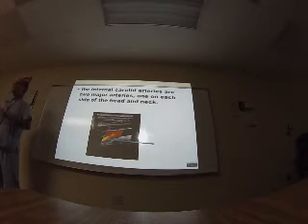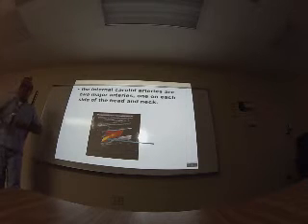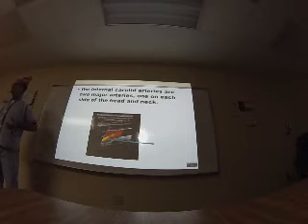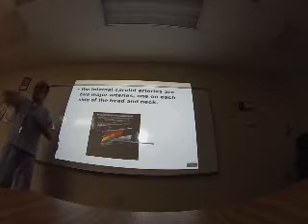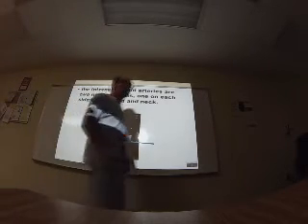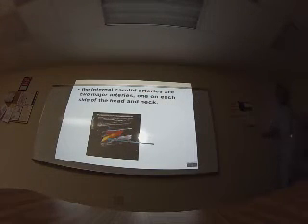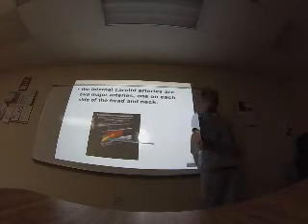Also, if you find a tumor and the flow is low resistance, you can suppose the tumor is malignant because it uses a lot of blood. If you have a tumor with high resistance, you can suppose the tumor is benign. Remember that the curves of high resistance and low resistance are different. This is the internal carotid artery.